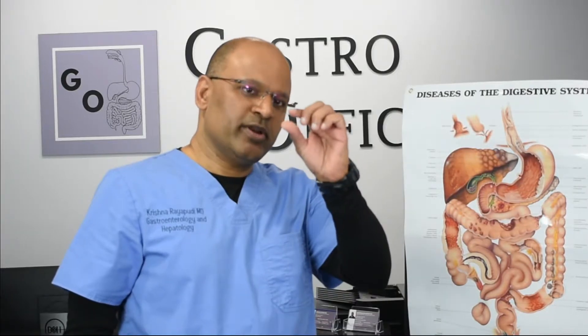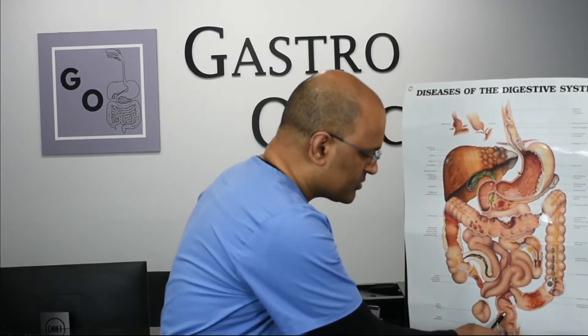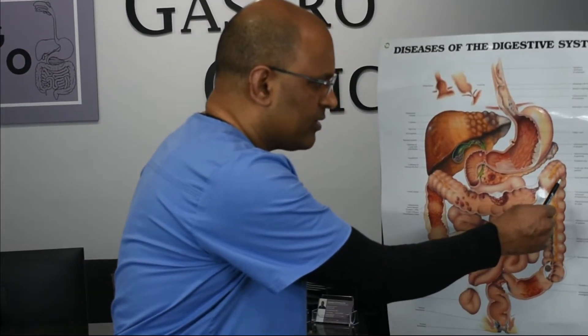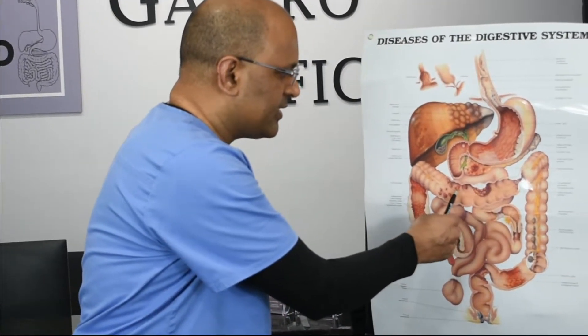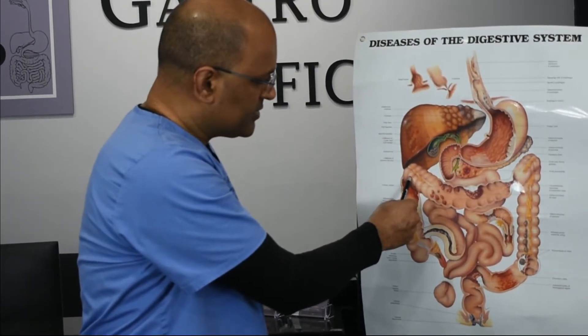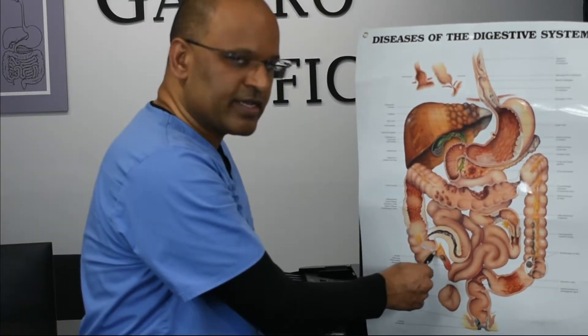We pass a scope and it goes right here at the anus, goes all the way into the rectum and then to the sigmoid colon, then the descending colon. Then we pass the splenic flexure into the transverse colon, and then pass the hepatic flexure and go through the ascending colon.